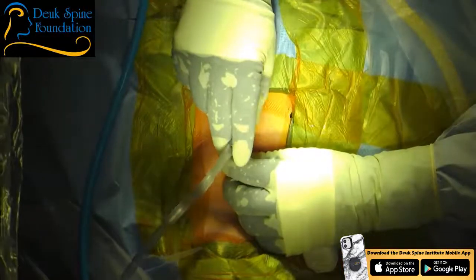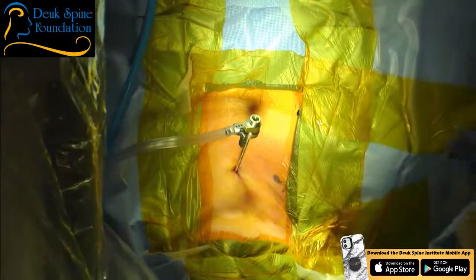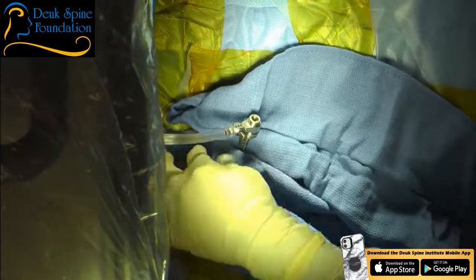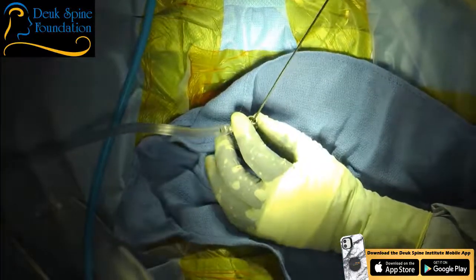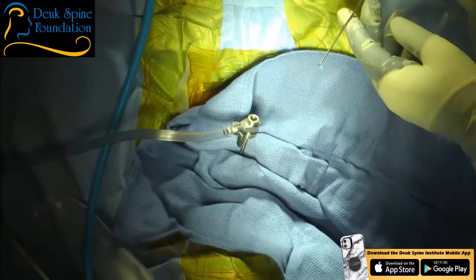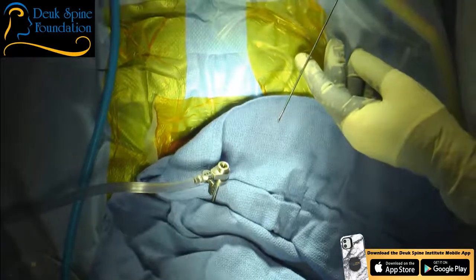All right. Let's get started. Keep that scope sterile. Move it back, please. Get your Raytech ready. I'm going to reach down and see if I can grab a piece of herniation. There's one right there. You all see that? So that's a piece of the herniation right there.